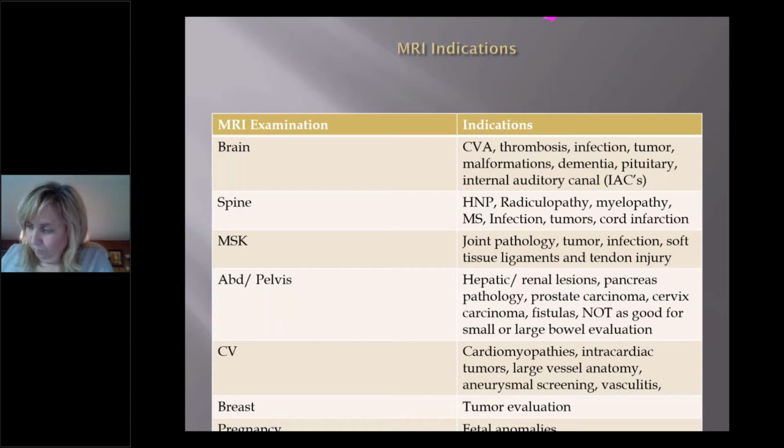Patients that have had prior shoulder surgery, MR arthrograms are helpful because there's going to be post-operative changes. It helps give you a better idea whether or not there's actually a tear or if it's just routine post-op findings. In the hip, you have a labrum as well. If you're worried about a labral tear in the hip, it's very beneficial to give contrast there, because I've had cases where MRI of the hip was ordered by somebody, read as negative.